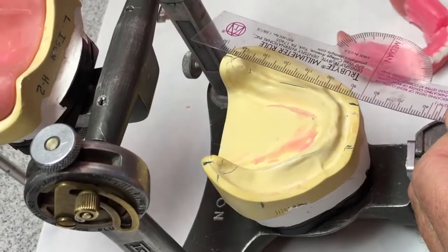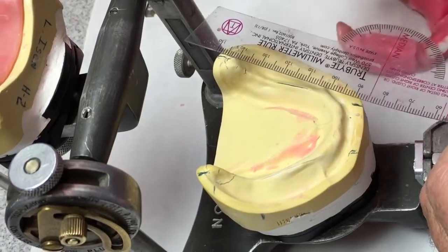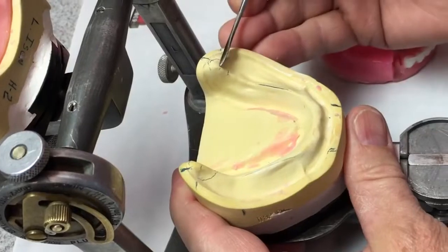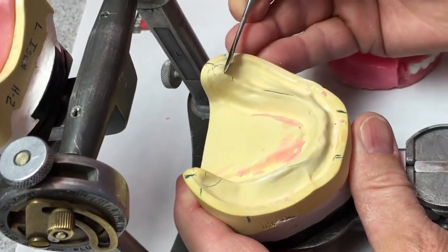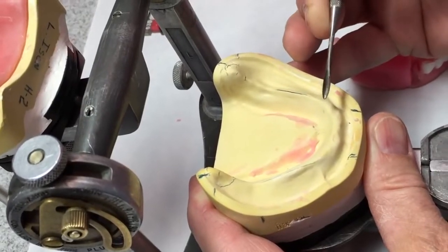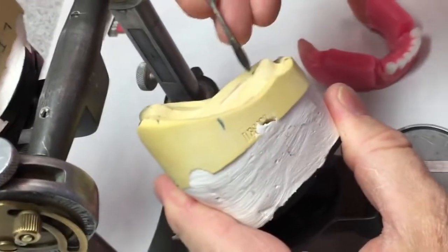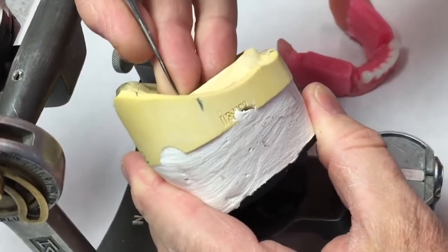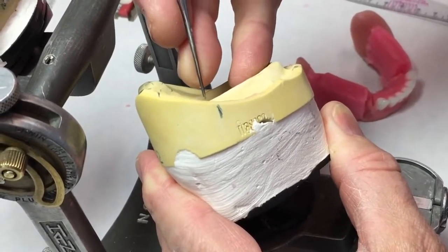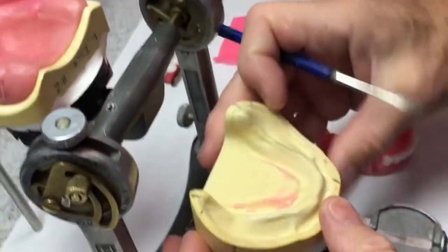I've already done that, and I want the central groove of the mandibular posteriors to be right on top of that ridge exactly. So I've got a line on there, extended here. While you're doing that, you also mark the occlusal plane — two-thirds to midway up the retromolar pad — extending from the incisal edge of where your anteriors are to that line. The third mark you make is where the ridge starts to make a steep rise. You mark it out there, and that's as far posterior as you set teeth. If we have to drop a premolar we will, but we're not going to set teeth on this rise — that's going to cause a denture to push forward.